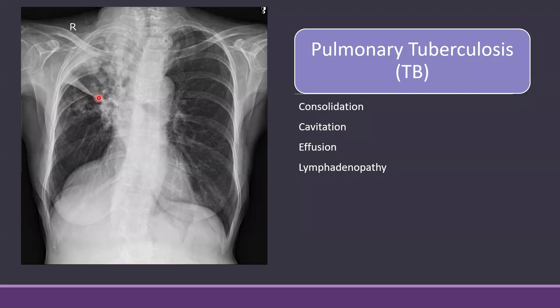This was a case of tuberculosis and the history was suggestive. There was a two to three months history of productive cough, fever, weight loss, and anorexia — and the fever was with night sweats. TB can present with a consolidation like this in the upper zones, with signs of volume loss as we can see here.